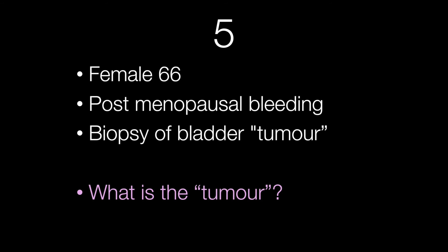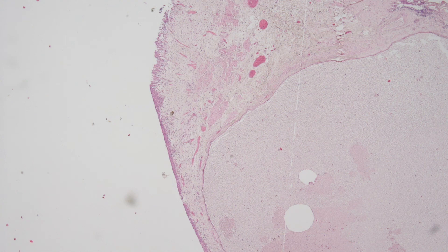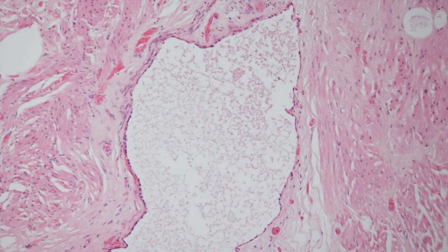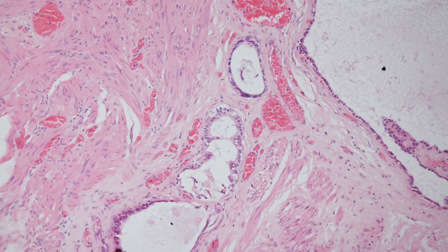Question number five is a bit more tricky. This is a female of 66 who presented with postmenopausal bleeding, and a biopsy was taken of the bladder tumour. What is the tumour? Here are a number of different fields of the lesion.